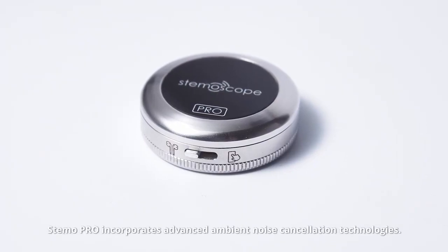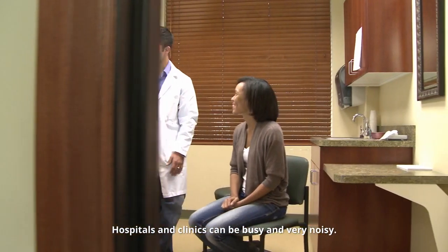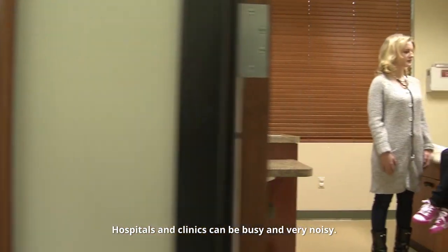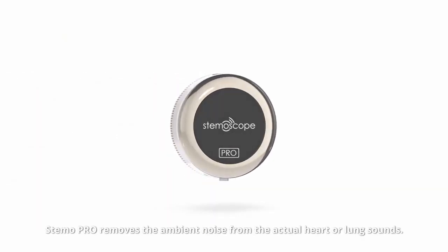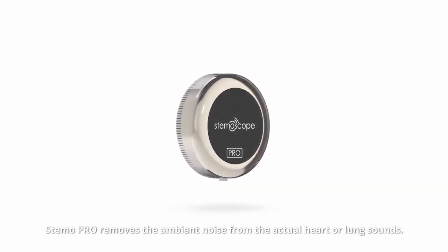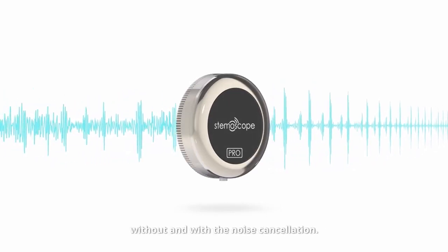Stemo Pro incorporates advanced ambient noise cancellation technologies. Hospitals and clinics can be busy and very noisy. Don't worry about that. Stemo Pro removes the ambient noise from the actual heart or lung sounds. Let's listen to some samples we recorded without and with the noise cancellation.